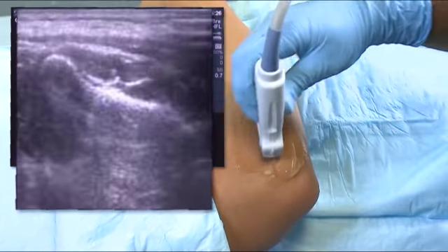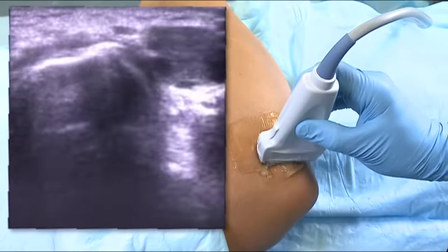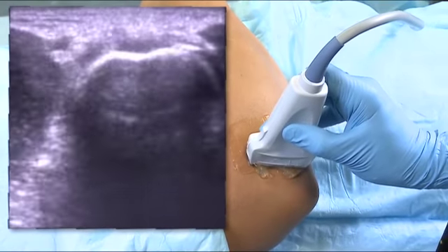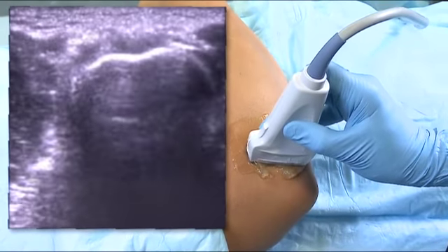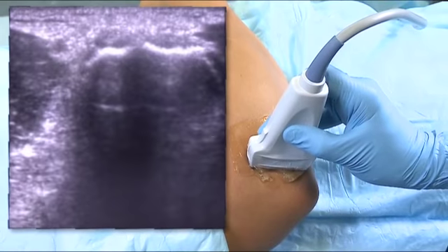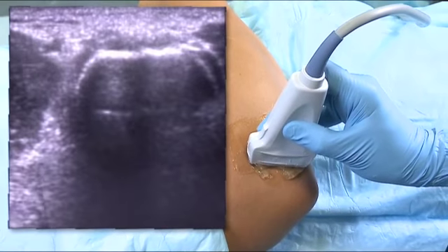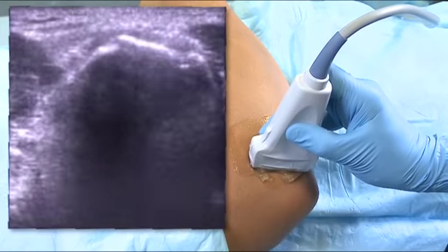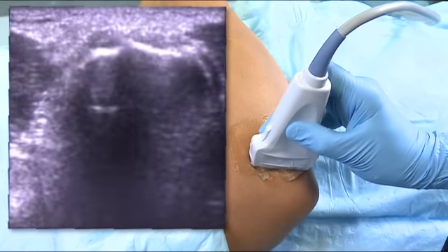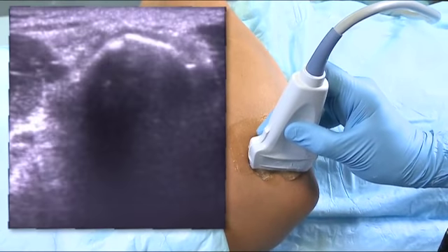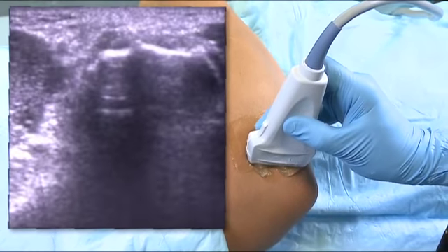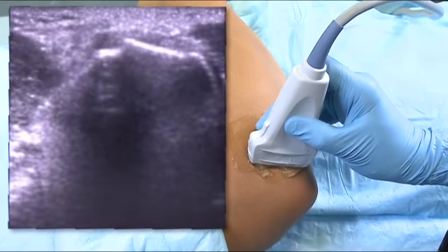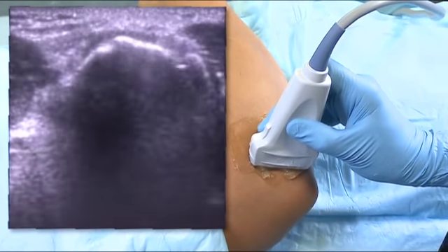You can also confirm this and evaluate the content through an orthogonal or transverse view. There is the epicondyle, and you can see right above it, at the bony landmark of the epicondyle, a bit of the diseased area showing as dark or black areas of the tendon right above it.